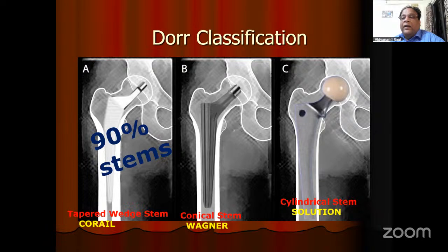And now you can safely put in an uncemented cup of 52. If the reamer was catching, the cup will fit. You put in the trial.